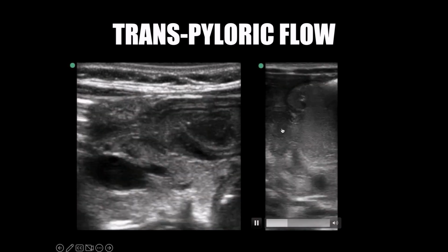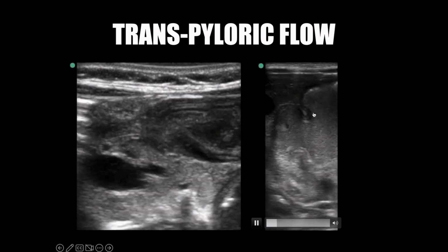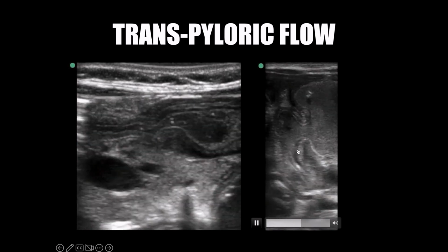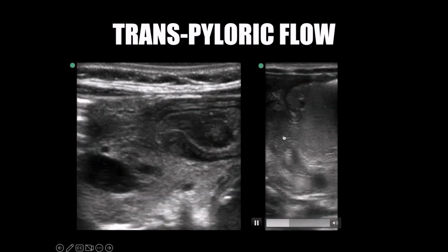On the right, we have another large distended stomach. You can see these muscle walls just churning, trying to get this gastric content out. You're not actually seeing the pylorus very well through most of this. It comes in right down here. What you ultimately see is that none of this stuff is managing to make its way out of the channel.